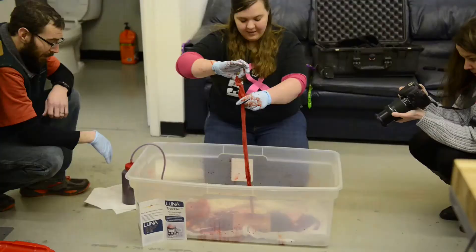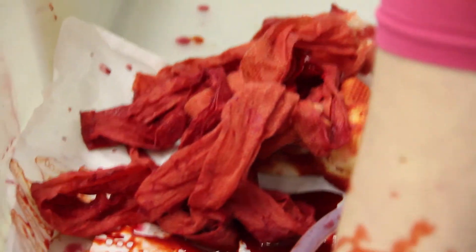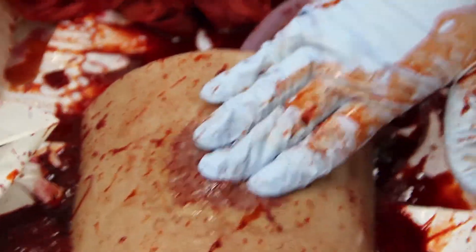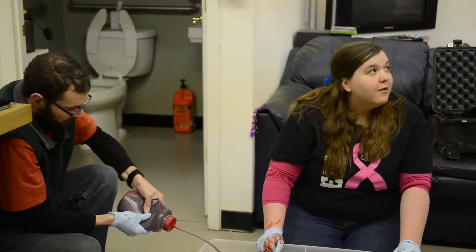If we pull it out — it's like a magic trick, it really is. Out it comes. And that's what they would do when they got them to the OR — you'd want to leave it packed for as long as possible, then put direct pressure on it because it's an actual wound, wrap it up, and get it to stop bleeding as much as possible. They'd probably go to a trauma center and take care of them. It would only come out whenever they're ready.